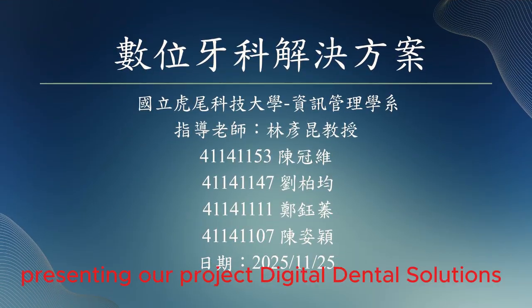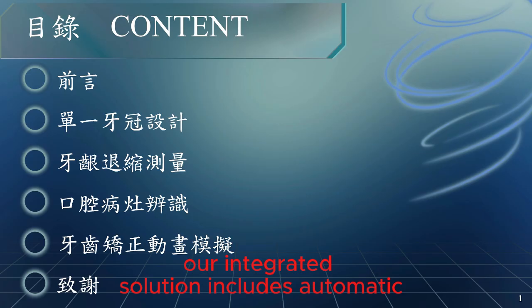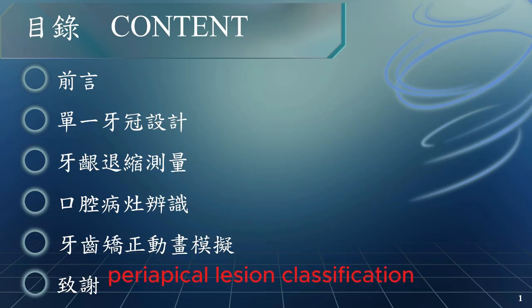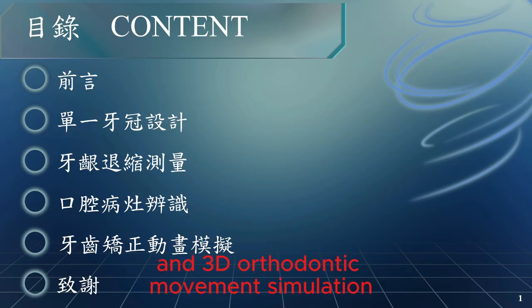We are Group 6, presenting our project Digital Dental Solutions. Our integrated solution includes automatic single crown design, gingival recession measurement, periapical lesion classification, and 3D orthodontic movement simulation.